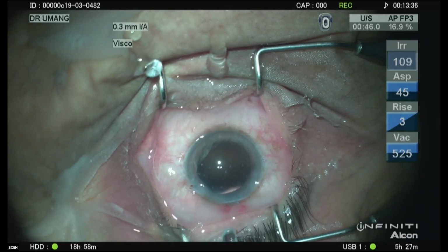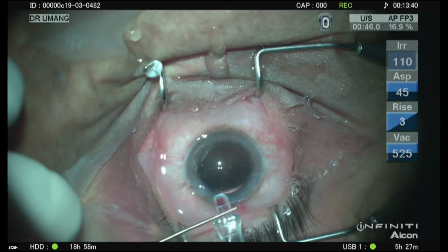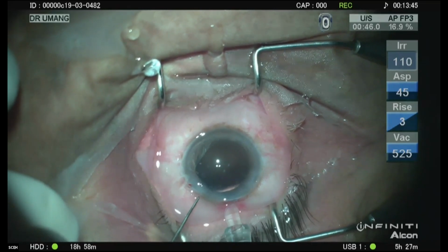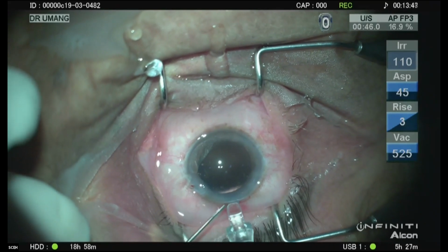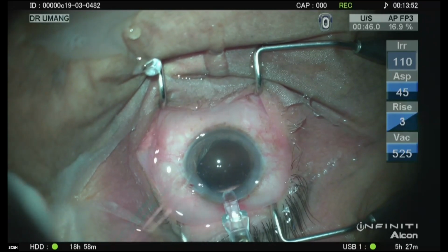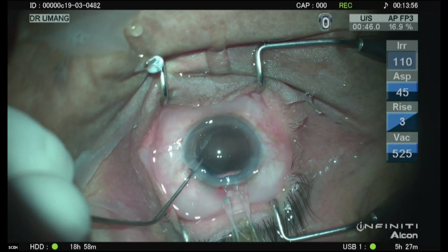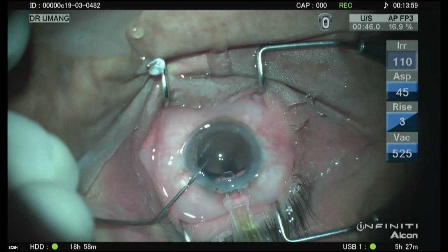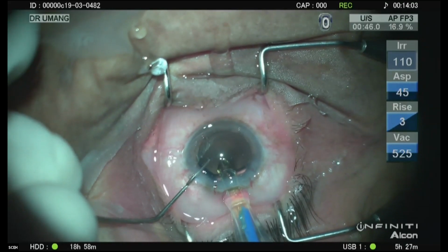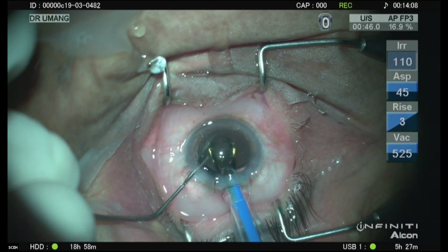The interesting thing that this device has is that it's got kind of a lock here. And so it doesn't go further inside the wound, because sometimes the tendency is if you take it way too inside, there's no space left for the lens to unfold. So this is a guard that is there. So we take it inside the wound and it snugly fits there. And we inject into the bag.